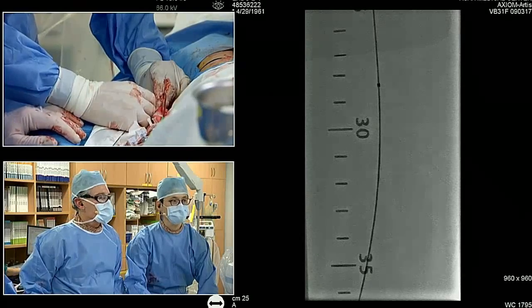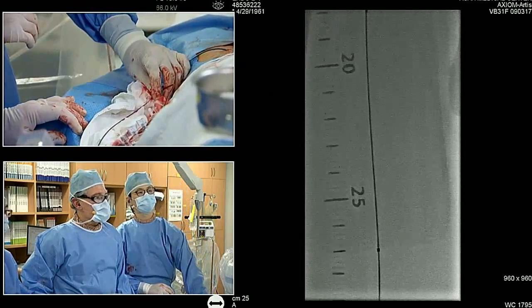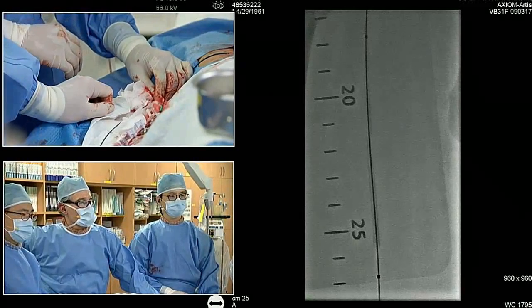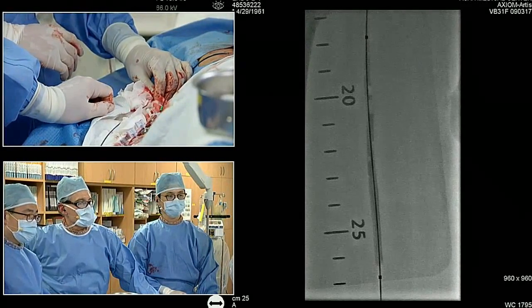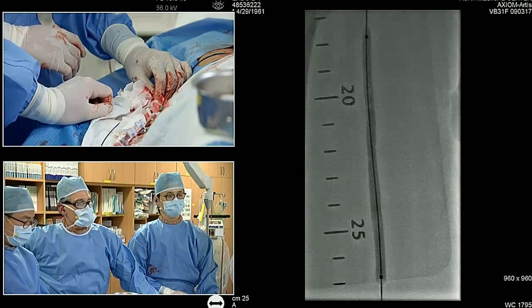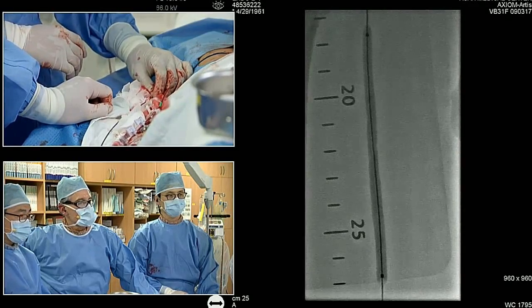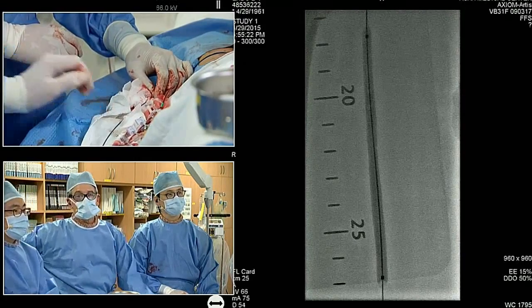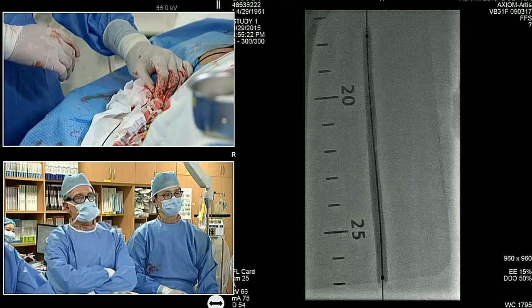That's pretty good there. Okay, go up gradually to 4 again. The vessel might be a little larger up here. He's feeling it pretty significantly. So we're going to stay at 4 atmospheres.